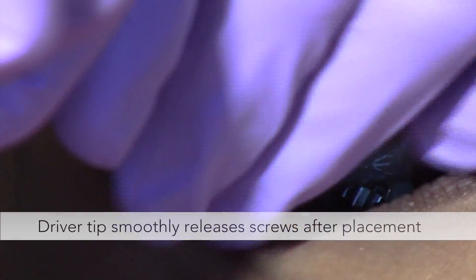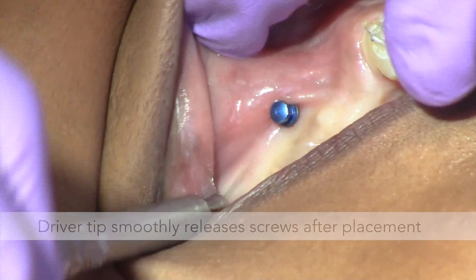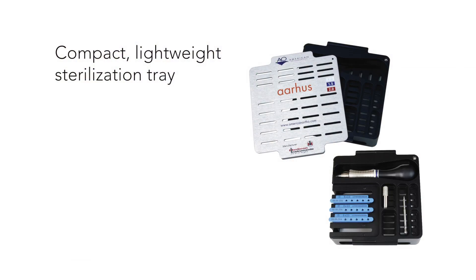The driver tip also smoothly releases screws after placement, minimizing any disruption when disengaging from the driver tip. The Aarhus system is easily delivered chair-side with a compact, lightweight sterilization tray.